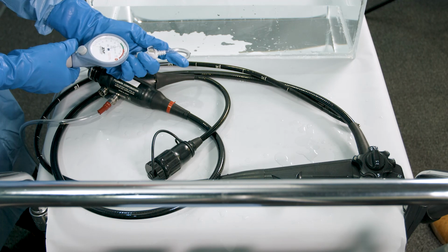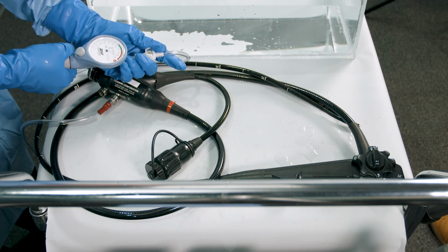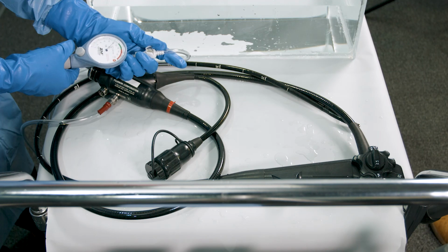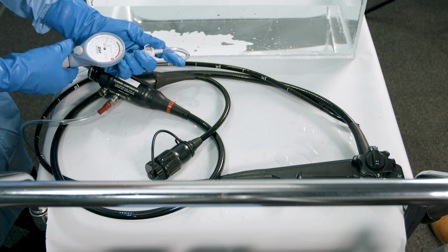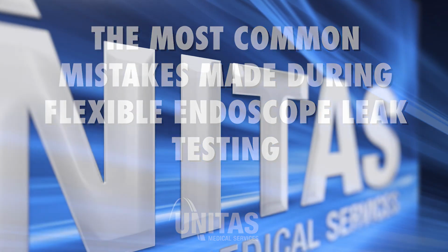Utilizing a handheld leak tester instead of electric makes you, the human pump, responsible for keeping the pressure within the safety zone during all of the subsequent cleaning steps. This may even take two people, one to pump and one to clean. This concludes the most common mistakes made during flexible endoscope leak testing.